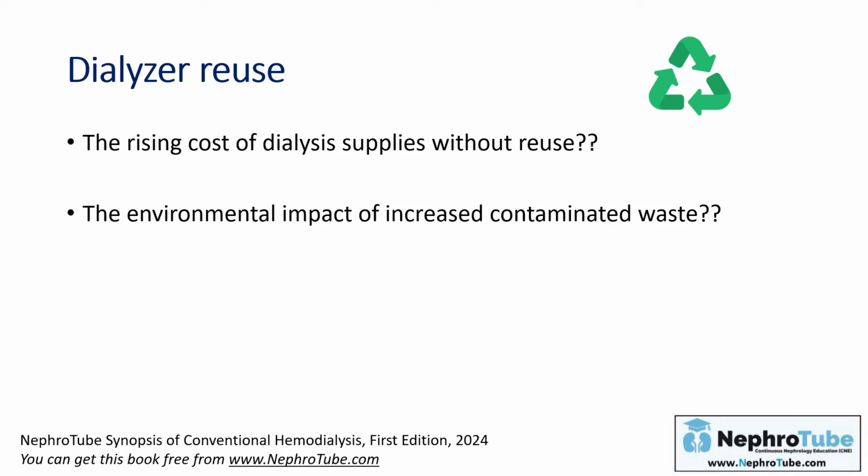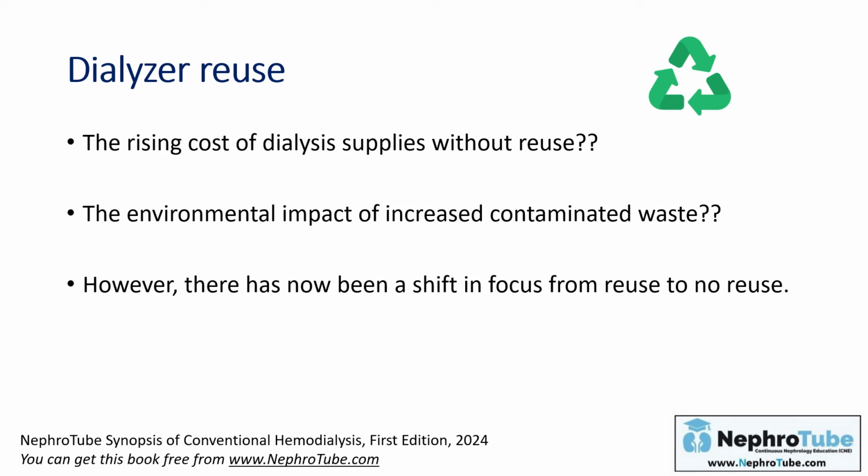So without dialyzer reuse, there is an environmental impact of the contaminated wastes. Despite this, there is now a shift from reuse to no reuse. Despite the theoretical benefits of reuse, the shift now is to not reuse.